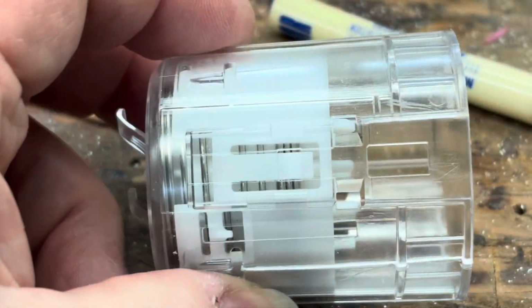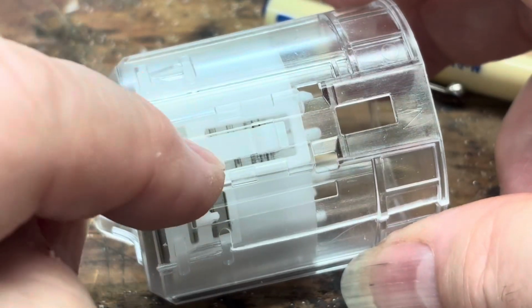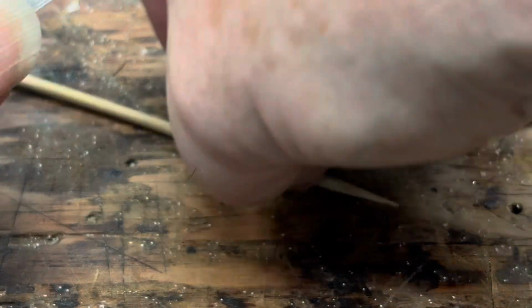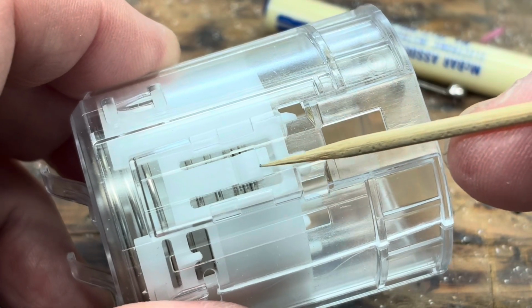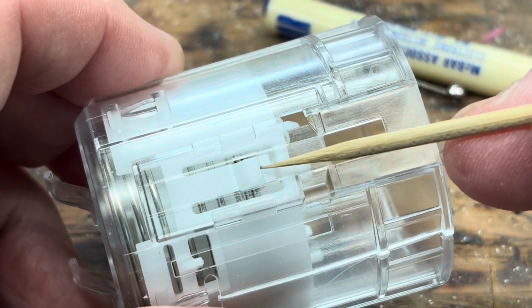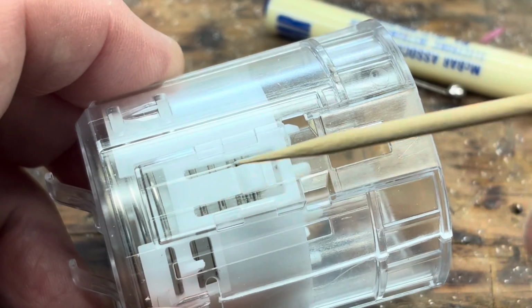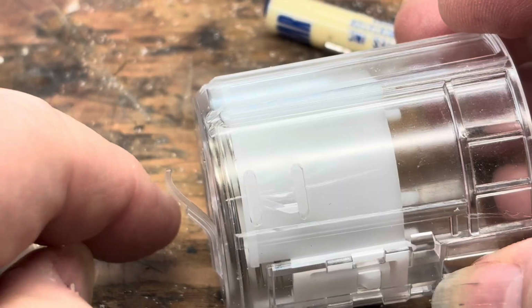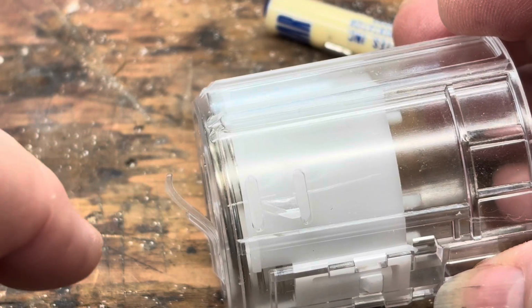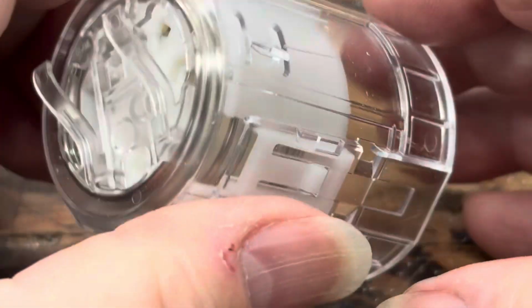Okay, pause. This is a cup 3-4 assembly inserted inside cup 2 so that the latching mechanism is hooked in that square in 2. So this is now armed. Here's the spring that's going to fire 3 that way towards the patient. And here's the 2 springs that are going to hold cup 2 up in cup 1. I'll explain more about that in a minute.